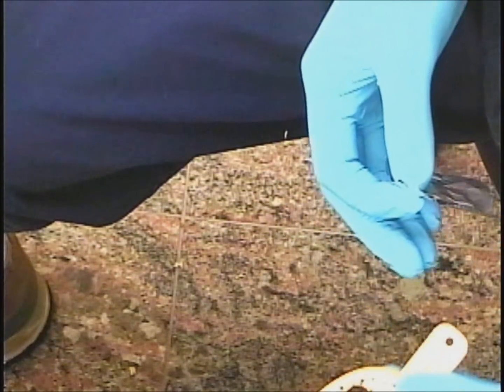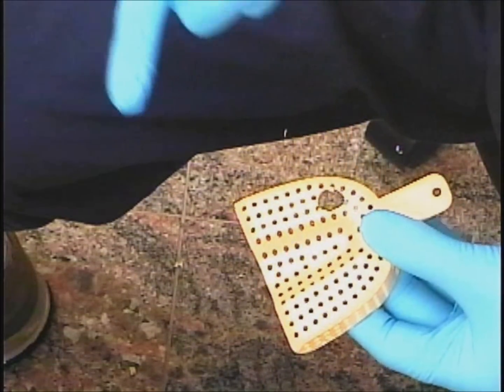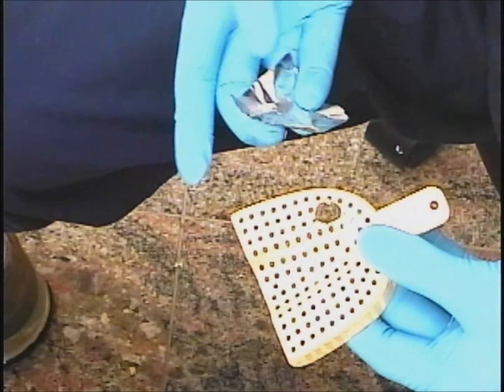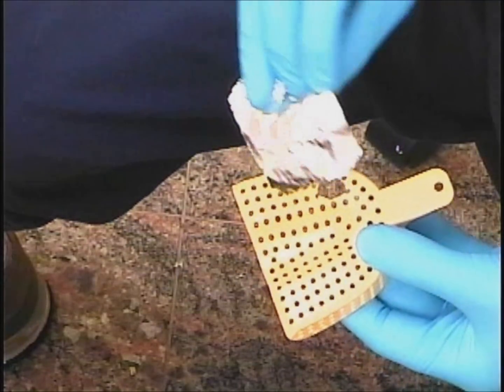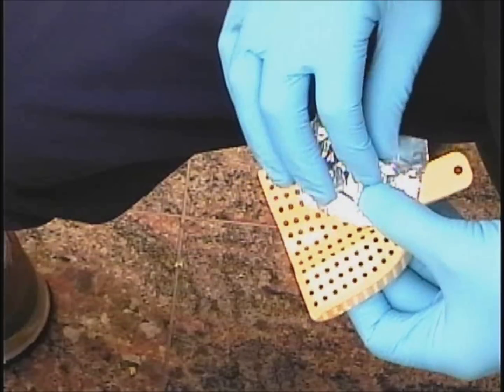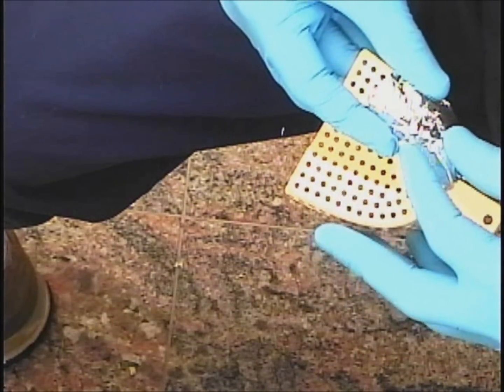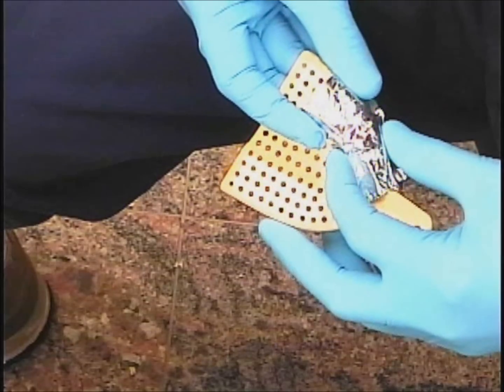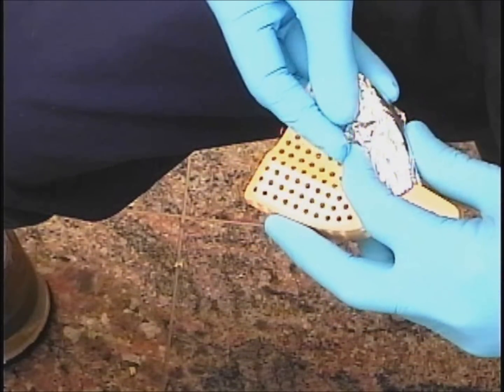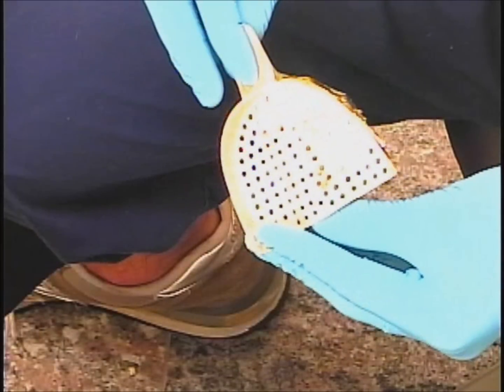Now I'd like to seal up that hole, so I'm going to use tin foil and some sticky wax. Why do I seal it up? Why not just take the impression? Well, my rationale — and what a lot of people do — is I just don't like having that impression material splurge out all over the place. By putting some tin foil and adapting that to the tray, and then keeping that in place with some sticky wax, I'm making sure I retain that impression material and hug it right up against the impression coping. So theoretically it's a little more accurate, but I can certainly tell you it's a lot less messy.